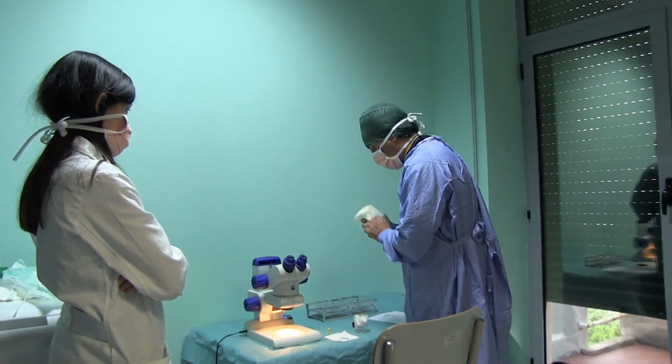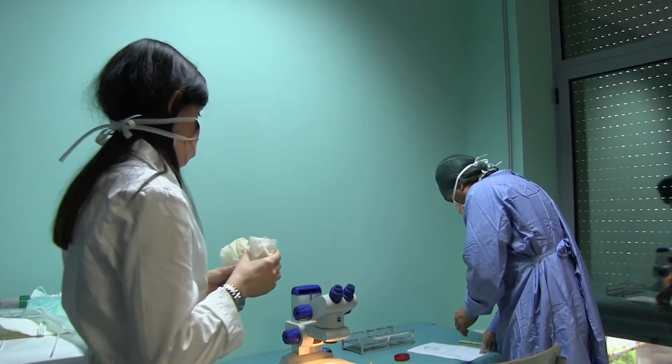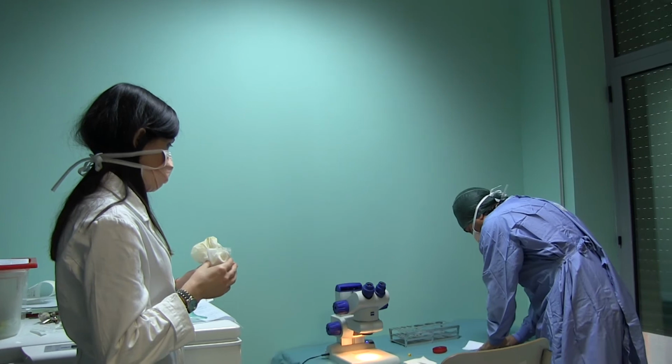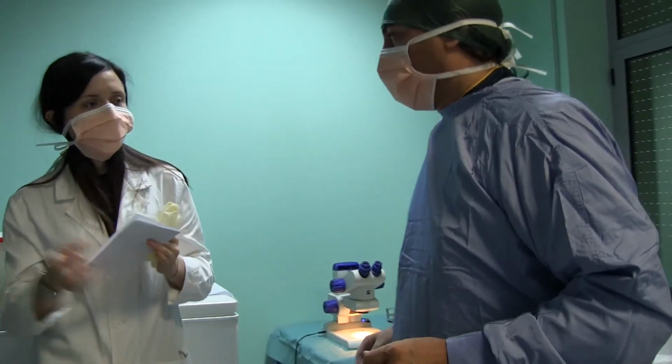In particular, we always recommend placing a sample of the core biopsy in a fixative suitable for electron microscopy, even in those departments where an electron microscope is not present, so that a subsequent observation can be carried out in another equipped department where this analysis can be performed.